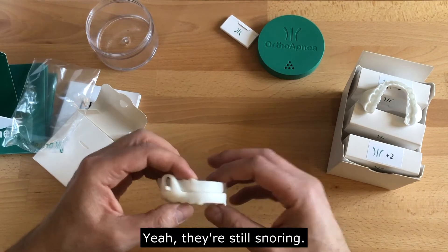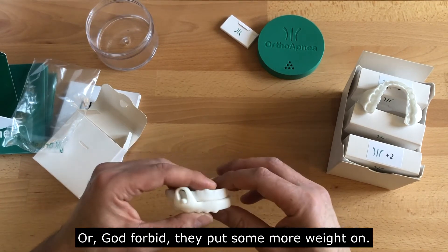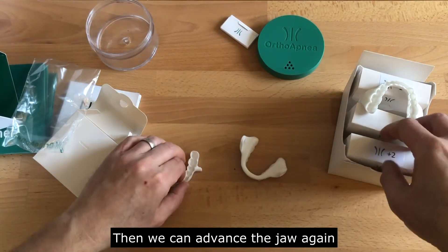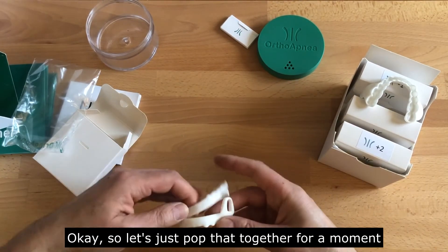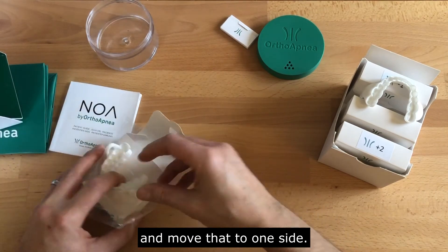Let's say the patient comes back — they're still snoring, or perhaps they've put on more weight. Then we can advance the jaw again with the next device. Let's just pop that together and move it to one side.